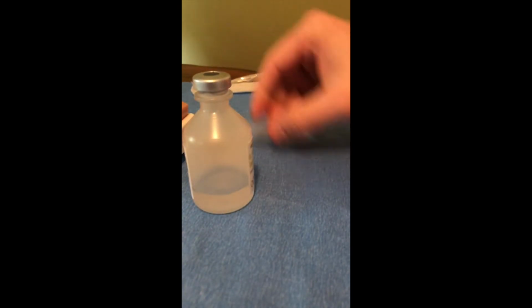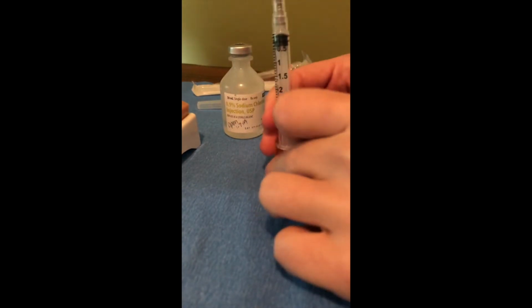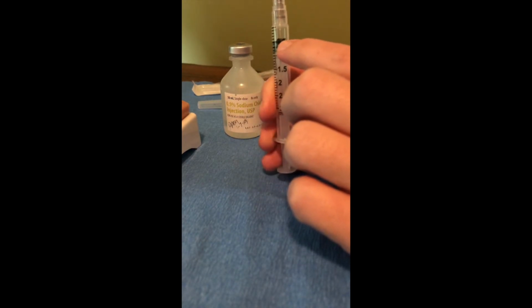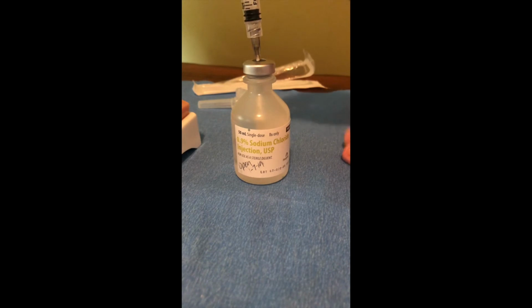Now I'm going to do the draw up of medication. I am only going to use 0.5 mLs. So right here is the marker. I'm going to pull back to the top of the black line there. So we're at 0.5. I'm going to remove my cap. I'm going to go ahead and inject my needle into the vial, push the air in, and then pull it up. And I'm going to start pulling back.